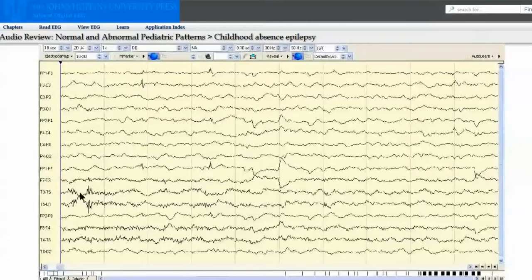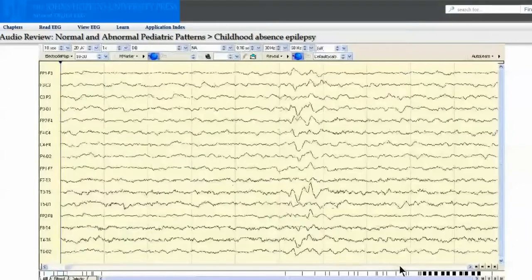What we have here also represents T5 electrode movement, but superimposed on it is muscle artifact, producing this brush-like pattern on both these derivations. Similar artifacts are seen affecting T4. Nonetheless, the feature of principal interest of this segment will be seen shortly. Of note, I've decreased the gain so that the voltage is reflected as 20 microvolts per millimeter.